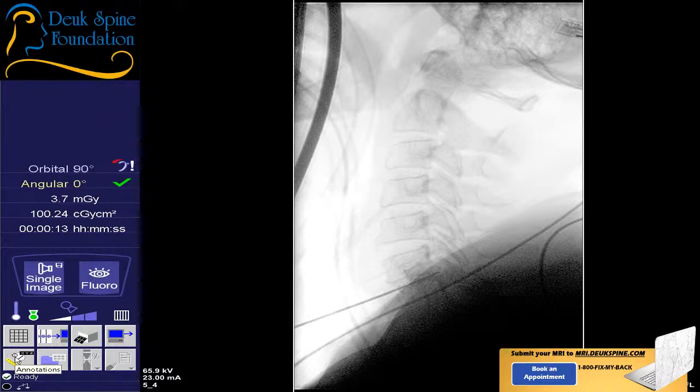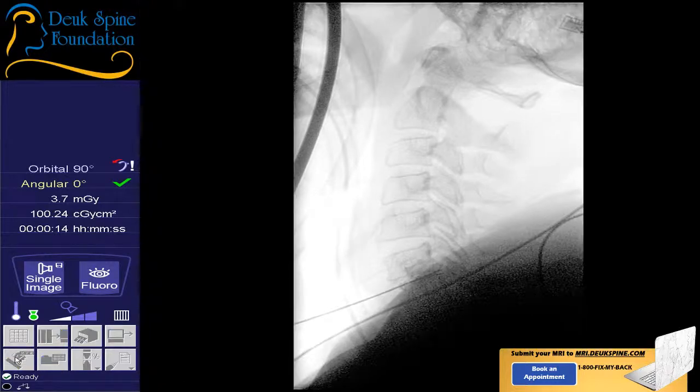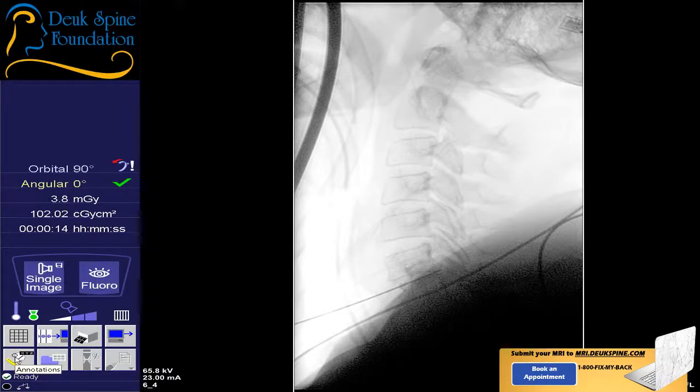So we're getting the guide wire in there, taking the needle out, and let's just make sure we haven't moved. Shot. Perfect. You can relax. Everybody relax a little bit. We're going to numb up the skin. We're getting ready to make our incision.